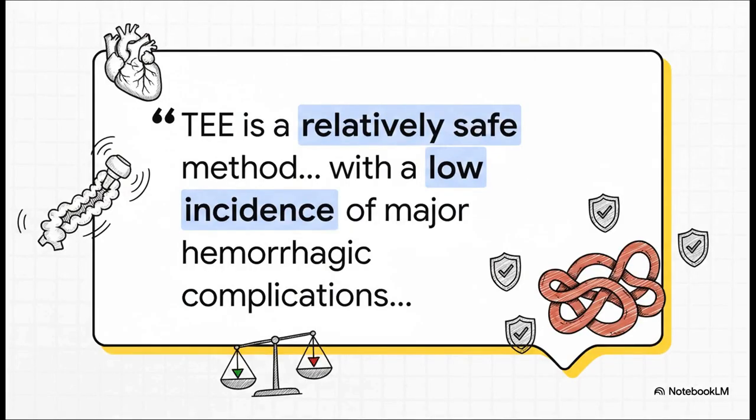So what's the big take-home message for our daily practice? It's that while the risk is never ever zero, the available evidence suggests that TEE is a relatively safe monitoring tool, even in this very high-risk population. This helps us make a much more informed risk-benefit decision at the bedside. It doesn't mean we can be cavalier about it, but it does mean that the mere presence of varices is not necessarily an absolute contraindication when the information you'd get from the TEE is clinically vital.